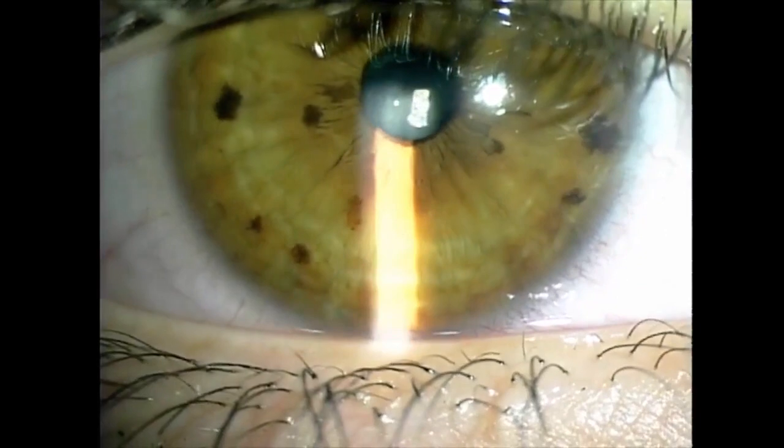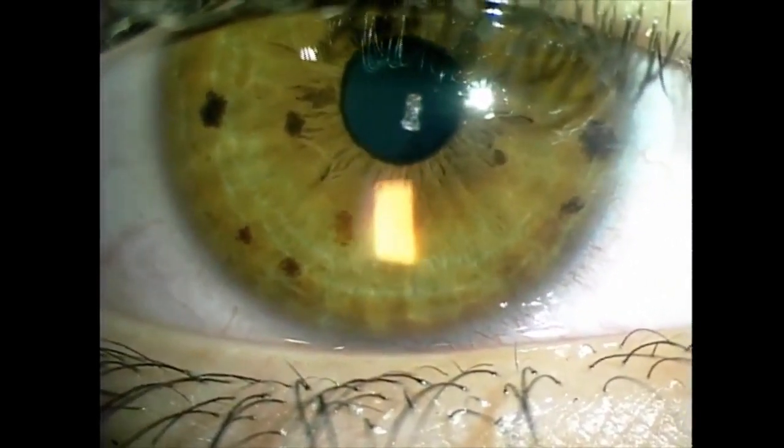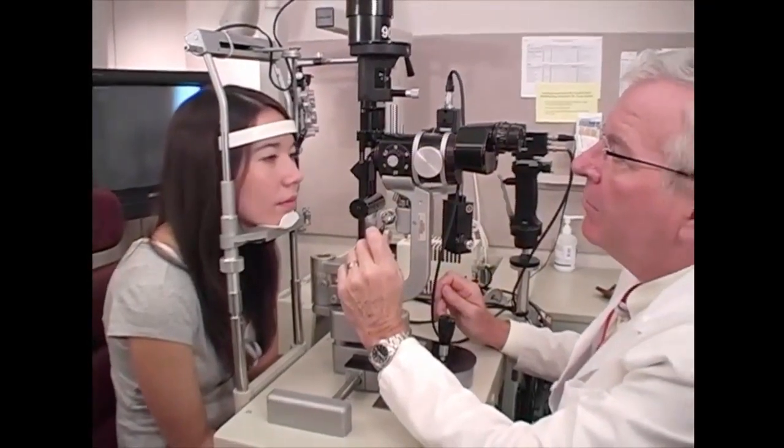So I want a dark room and a short beam of light, because as light floods the pupil, it opens the angle. And you can see that in this gonio video. I have quite a narrow angle, but as I open the light up and shine it into the pupil, it causes the angle to open. So a short beam of light, dark room. I'm not flooding the eye with light, because that's going to change the anatomy.